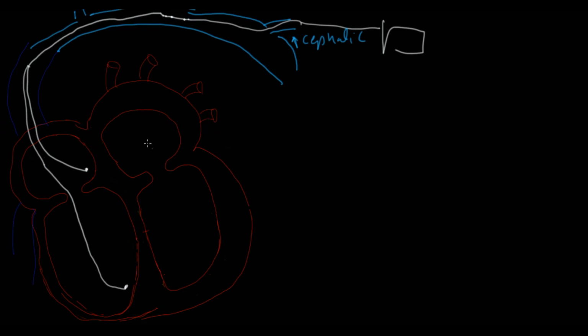So the option is basically either to perforate the atrium and go all the way, let's assume it's going to go all the way over there, or we can perforate the ventricle to go again over there. But these options are not really the best because it will induce myocardial injury. So the option that's mostly used all the time is to go through the venous system.